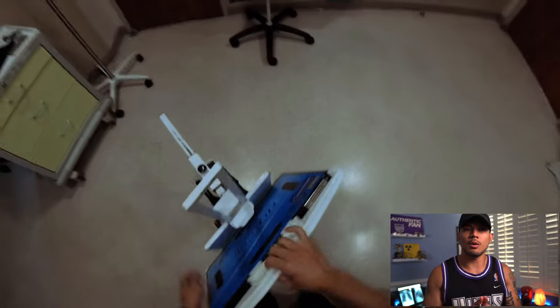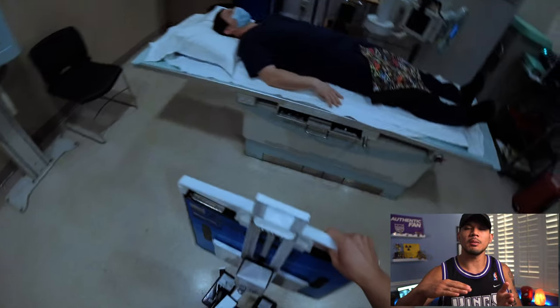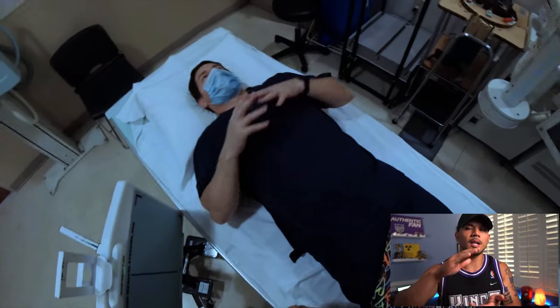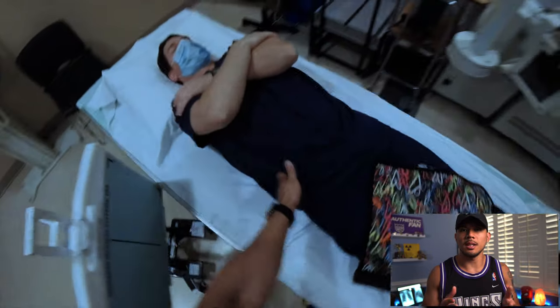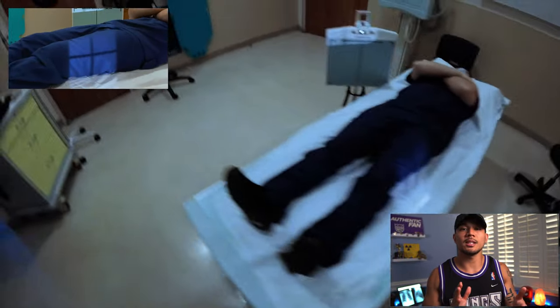Now, I prefer this grid holder over the other grid holder that you place on the table, because with this one, I can have it free floating off to the side and I can adjust the height of the table to get the area of interest in the center of the IR, the image receptor. With the other grid holder placed on top of the table, the area of interest ends up at the lower portion of the IR, increasing the chances of possibly clipping the posterior hip, because the patient's hips may be too sunken into the mattress. And yes, there is OID, however, I use the air gap technique. So instead of going at a 40 inch SID, I push it back a little bit so it minimizes the mag.